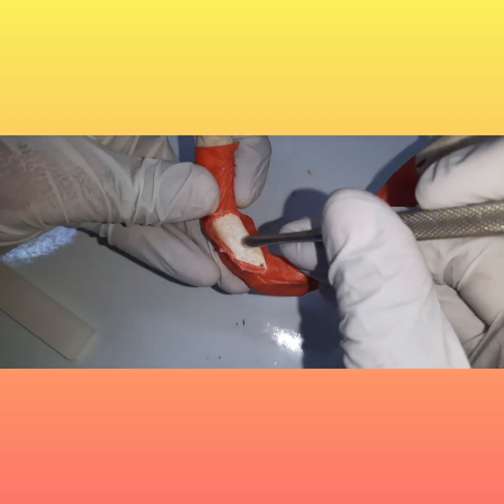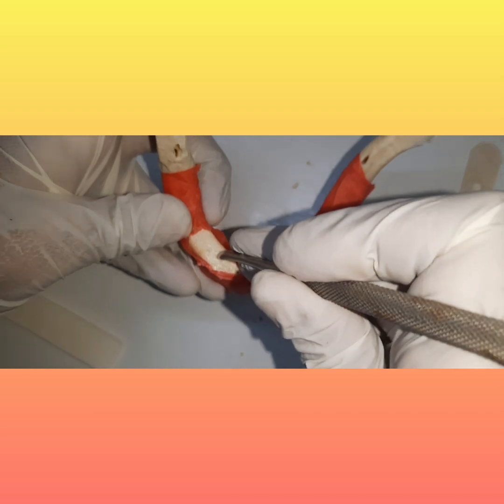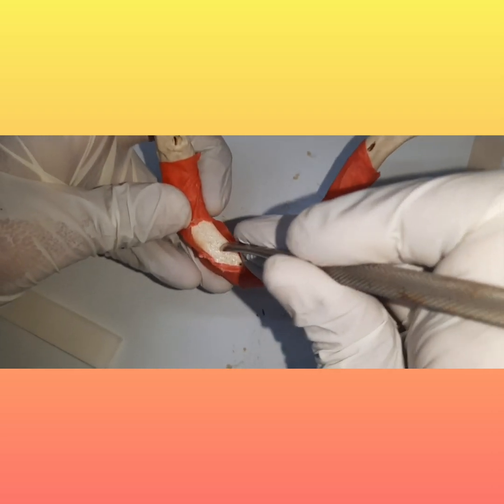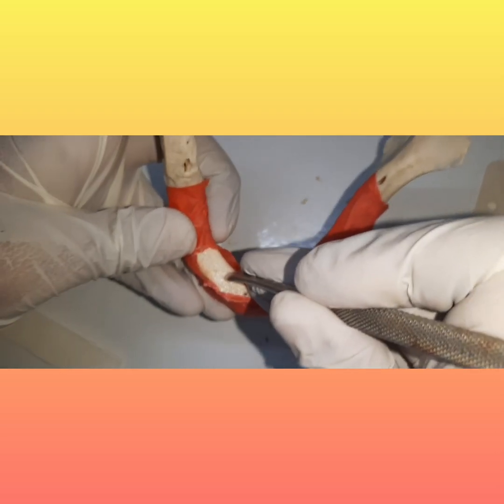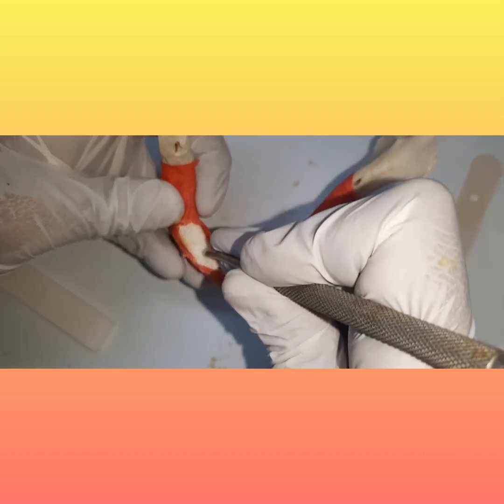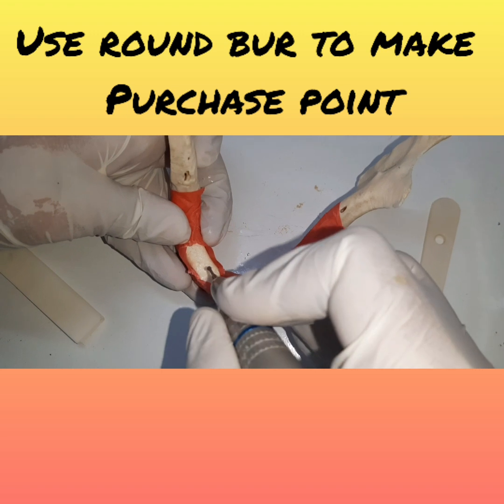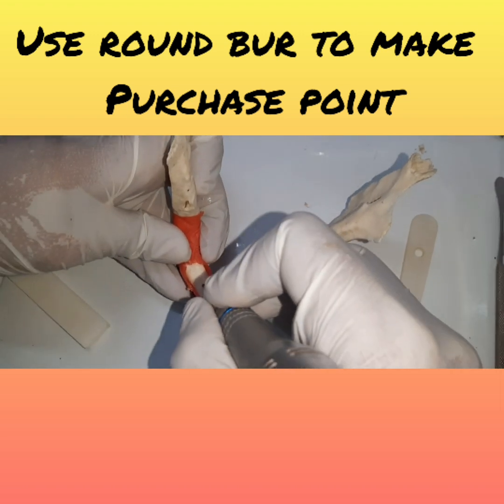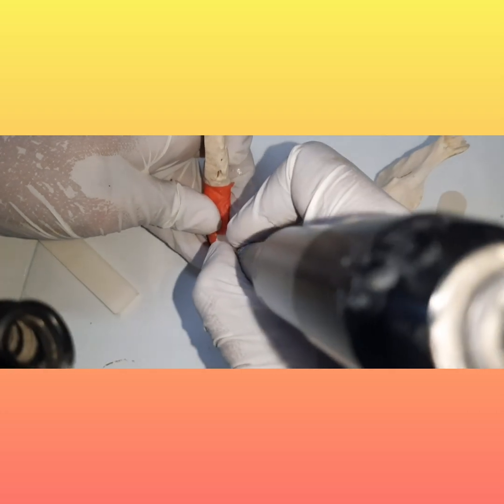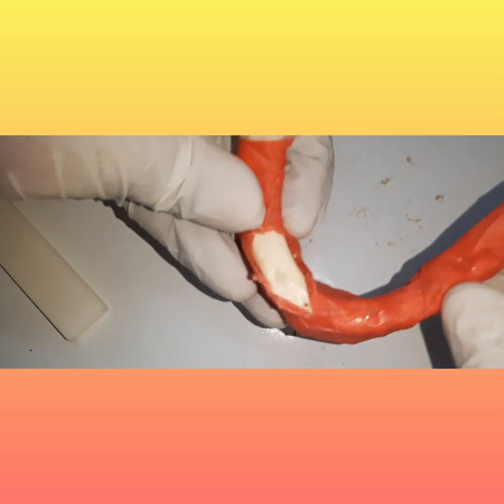So here we have the bone. You have this visibility of the bone. Here what we are going to do, first you are going to use a round burr in order to make a purchase point. So if you take this region, you will be making a purchase point here. You use a round burr and make a purchase point in the center. Stabilize your hand, very important, and just make a purchase point like this, as you can see.